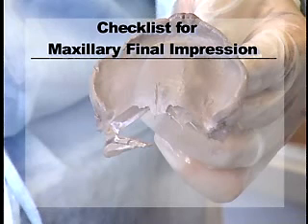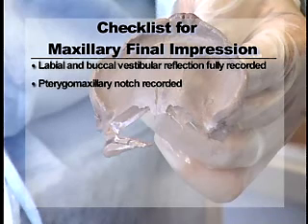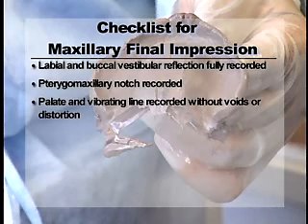Checklist for maxillary final impression. Labial and buccal vestibular reflection are fully recorded. Pterygomaxillary notch is recorded. Palate and vibrating line recorded without void.